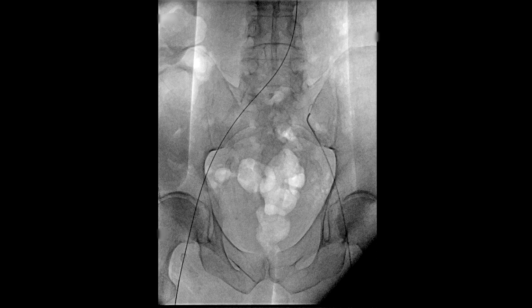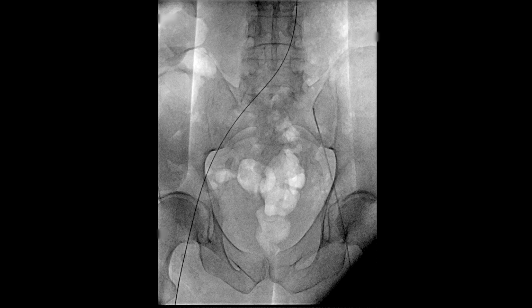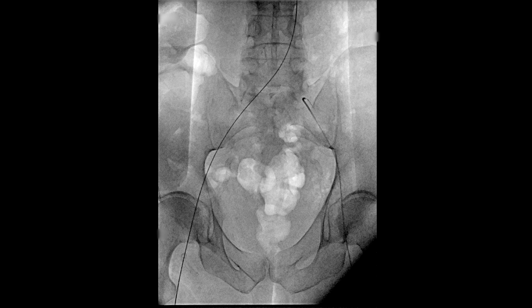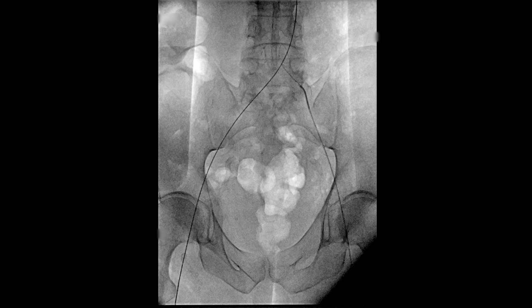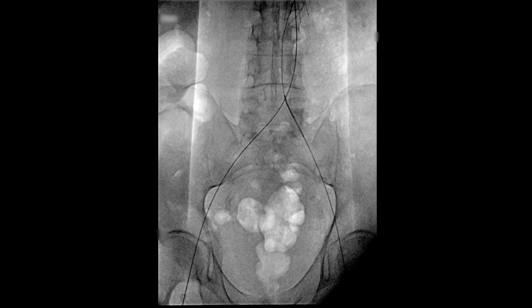Here you can see the wire buckling, but sometimes finding a small channel on the right side of the patient. Once this is found, the movements are brought much smaller, and the wire is buried into this softer portion of the thrombus. The catheter is then advanced, and now you see it torqued into the thrombus to allow for a channel to be created, and the wire is then advanced into the inferior vena cava.